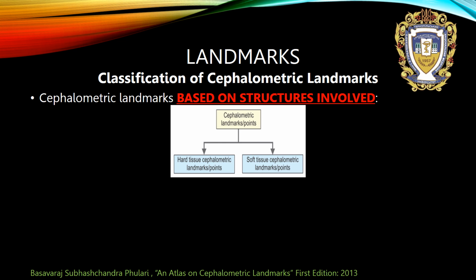Another classification: cephalometric landmarks based on structures involved. Based on this, there are hard tissue cephalometric landmarks and soft tissue cephalometric landmarks and points.